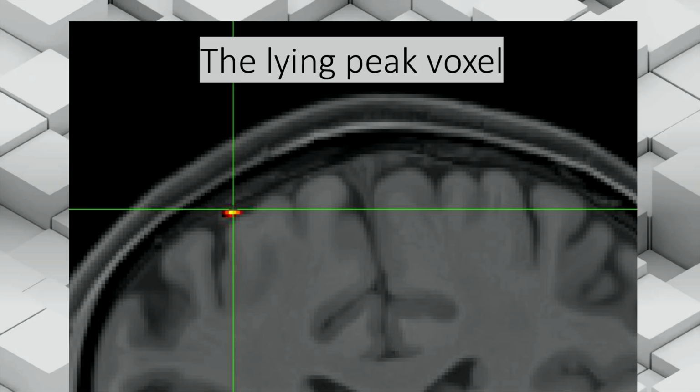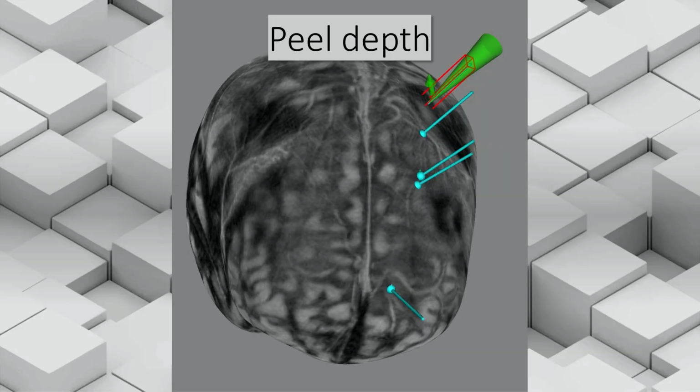Another thing is that within the software, it does its own version of a brain model that has certain regions where you can still see some of the blood vessels, and so you can play along with the peel depth of that image to look at your fMRI target. So that's something to be cautious about. There I'm demonstrating that.